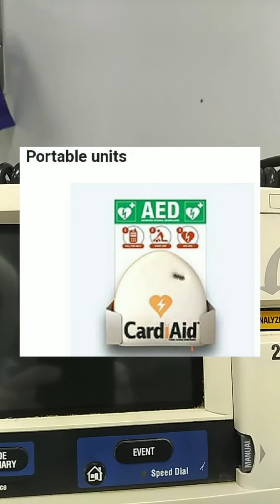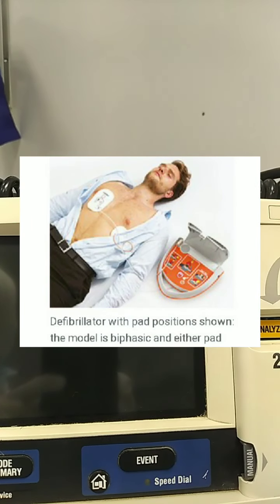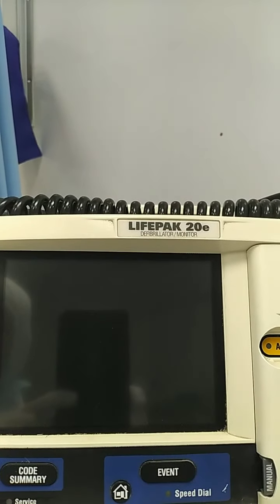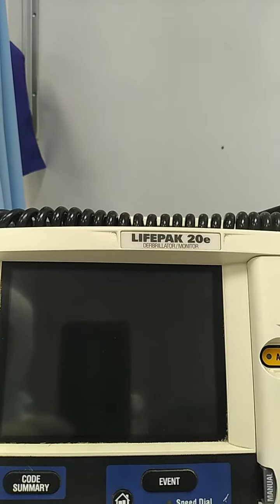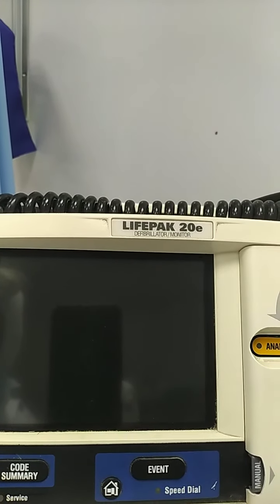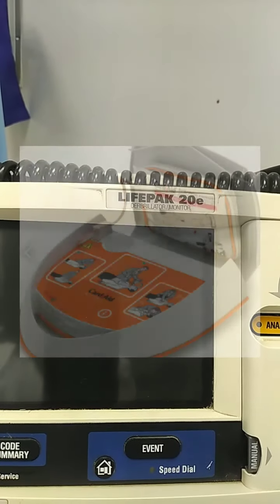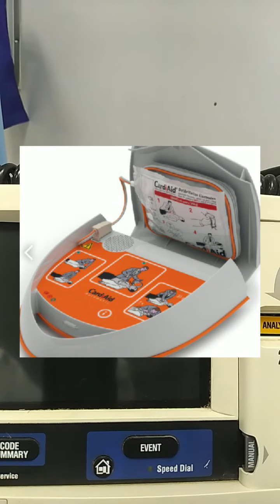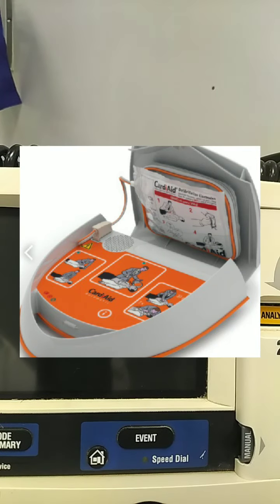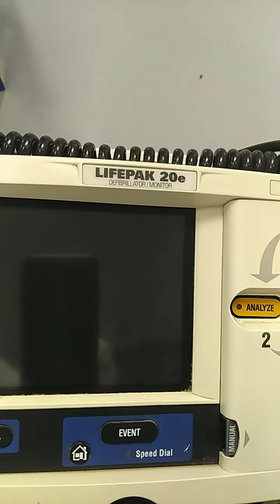There are two kinds of defibrillator: an automated external defibrillator, usually called an AED, and the manual cardioverter or defibrillator machine. An AED machine recognizes shockable rhythms and sets current levels automatically. Some AEDs also defibrillate automatically, but others prompt you to defibrillate. AEDs have electrode pads with incorporated gel.